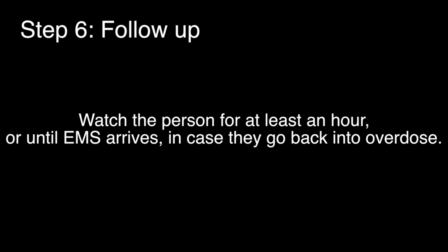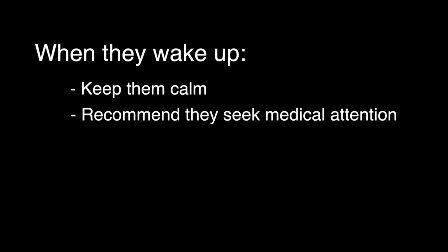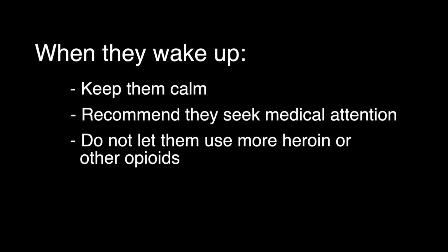Watch the person for at least an hour or until emergency medical services arrive in case they go back into overdose. When they wake up, keep them calm. Recommend that they seek medical attention and help them if necessary. Do not let them use more heroin or other opioids. The naloxone will block it and they could overdose again once the naloxone wears off.